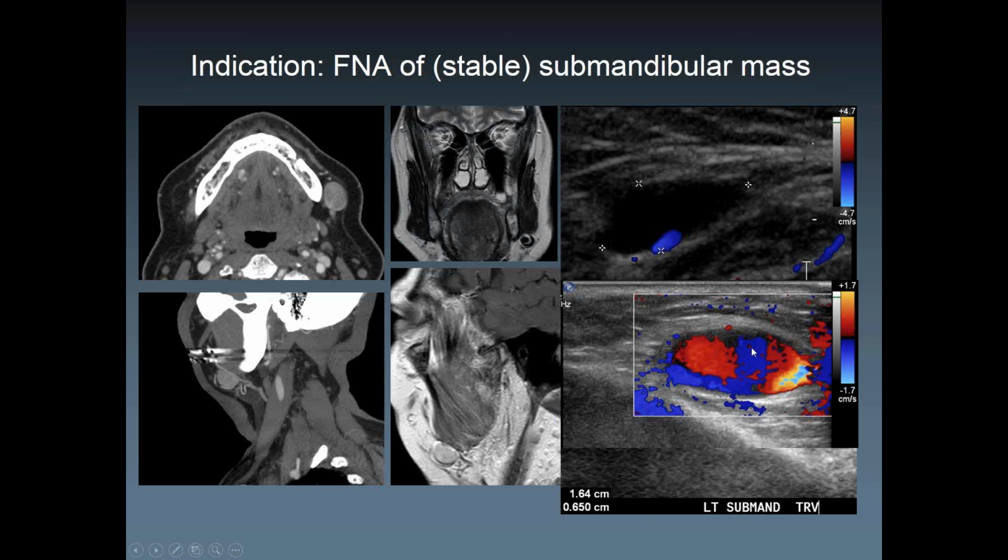As you go back to the MR and look closely, you could see a yin-yang sign on the coronal acquisitions here, which you did not see on the sagittal ones, at least on the ones with contrast. And this is a non-con T1 that shows you that flow can be hyperintense on T1. So it's important to realize that was not picked up in the report.